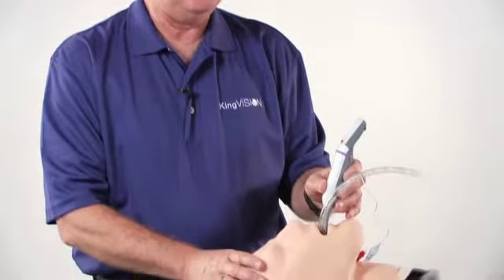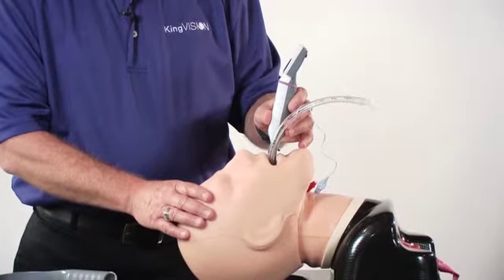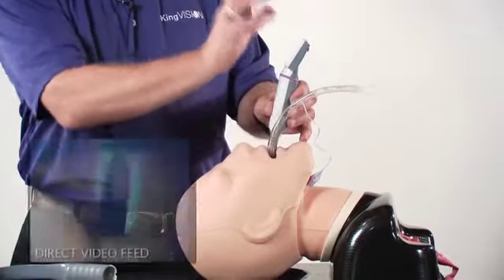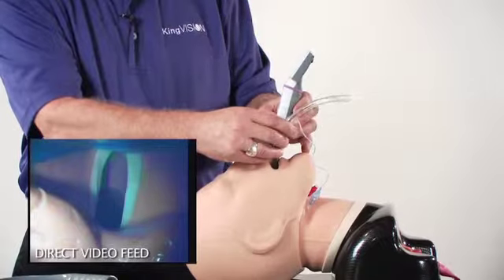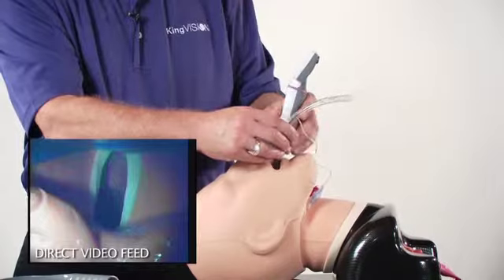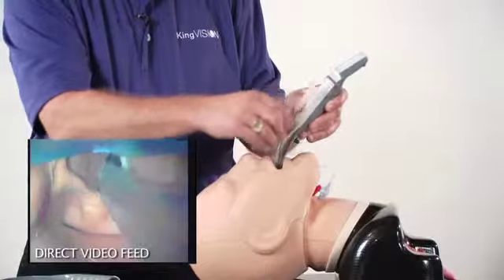It's very important with the KingVision video laryngoscope, like other video laryngoscopes, to not attempt to get a view that's too deep. In other words, the view of the vocal cords is up close and personal. What this accomplishes is you have a great view of the vocal cords, but the imaging sensor is in the way of the advancing tube. And so it's very difficult to advance the tube, and you're typically going to run into the right border of the laryngeal inlet or the right arytenoid. If this occurs, be sure you back out, lift up a little bit before advancing the tube into position.